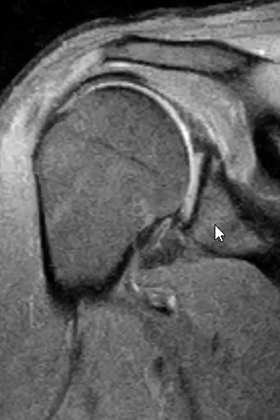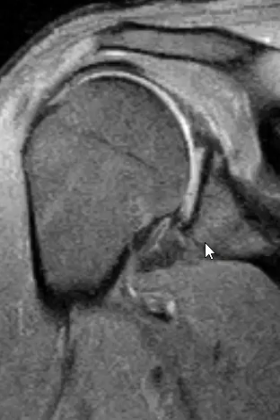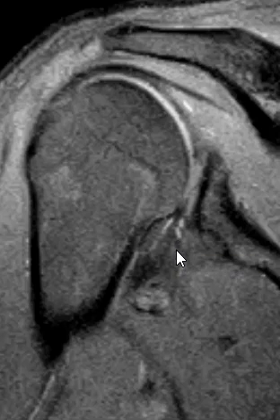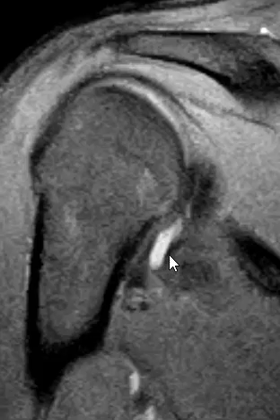Instead of having a nice black wedge, we see a little bit of gray signal right here, and then here we see these two little white specks — this is fluid within a tear of the labrum. And then there's another finding here: this is a little tongue-like projection of fluid, which is what they call a paralabral cyst. There's a tear of the labrum and fluid is coming out of that tear, going down, forming a paralabral cyst.